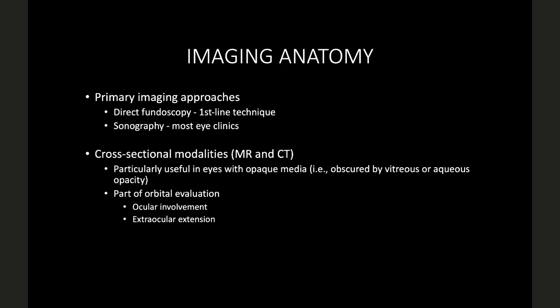When do you really get an MR? A lot of times CT replaces the MR for ophthalmology structures because there are certain structures anyway you cannot see. And when we go over the imaging anatomy, we are going to be looking at some of those. But like optic nerves and stuff like that, MR is really crisp and beautiful. And as neurologists, you guys will need to know a lot about those. So yes, that's where it plays in. So we are going to go in.